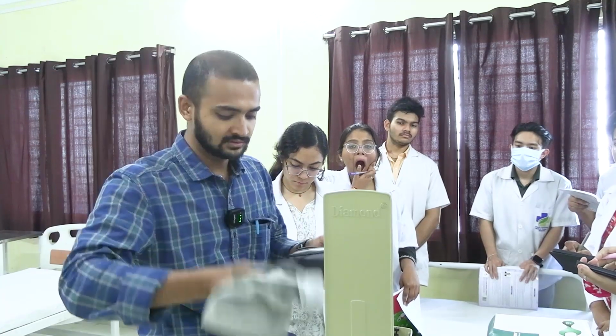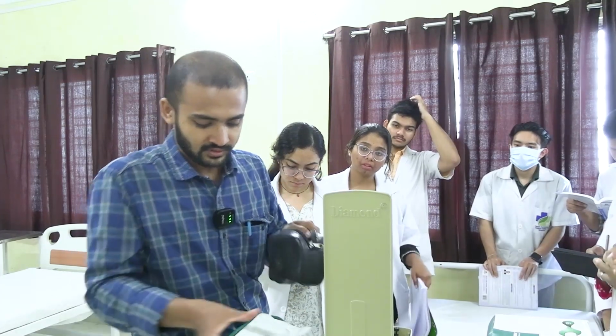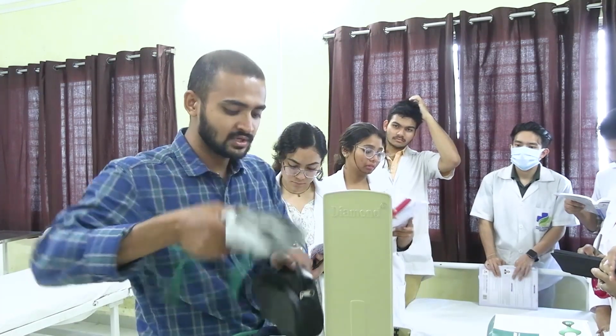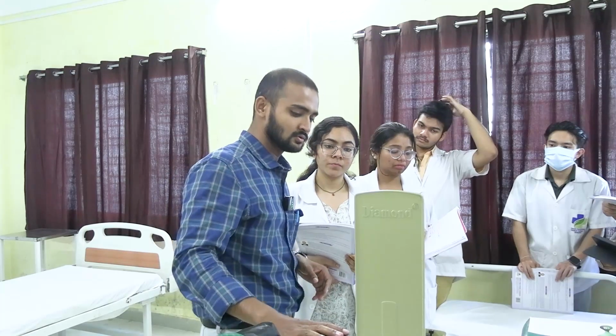You have seen the digital. So there are three types: this one is the mercury, this is the aneroid, and the other one is the digital. Okay, 3 types. So you have to know, as you said, the systolic BP.